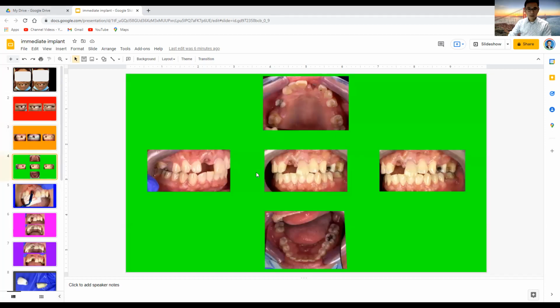Here's another intraoral photo that shows missing teeth on number 5, number 3, number 12, 13, number 8, a lot of missing teeth there. So what are you planning to do in this particular case? I discussed all the options with her. We can put an implant wherever it's missing. She doesn't have money, so she's only able to afford replacing the front tooth.